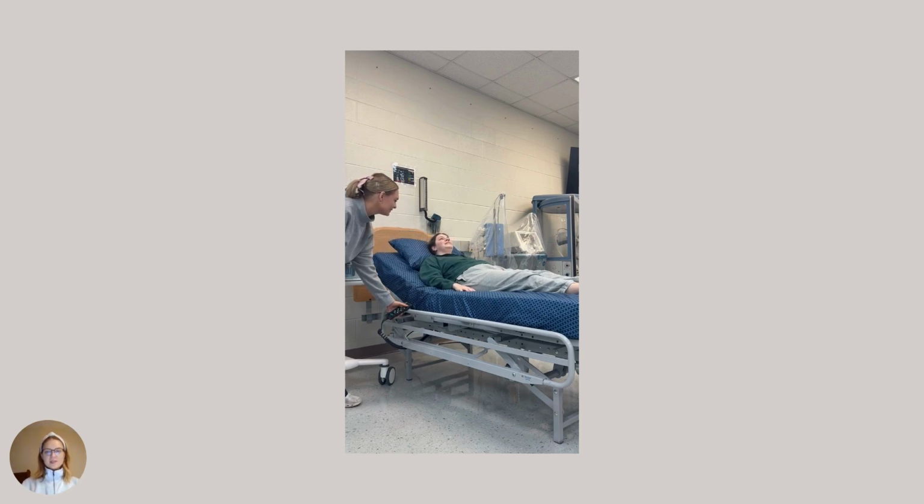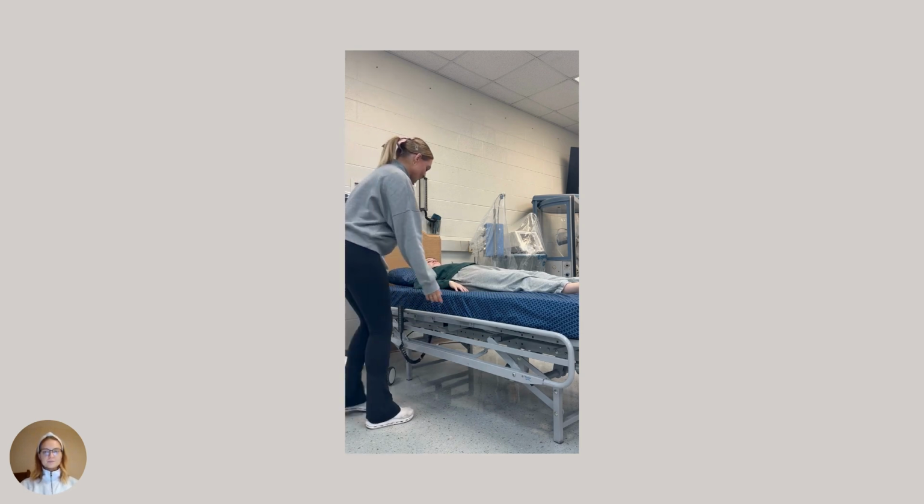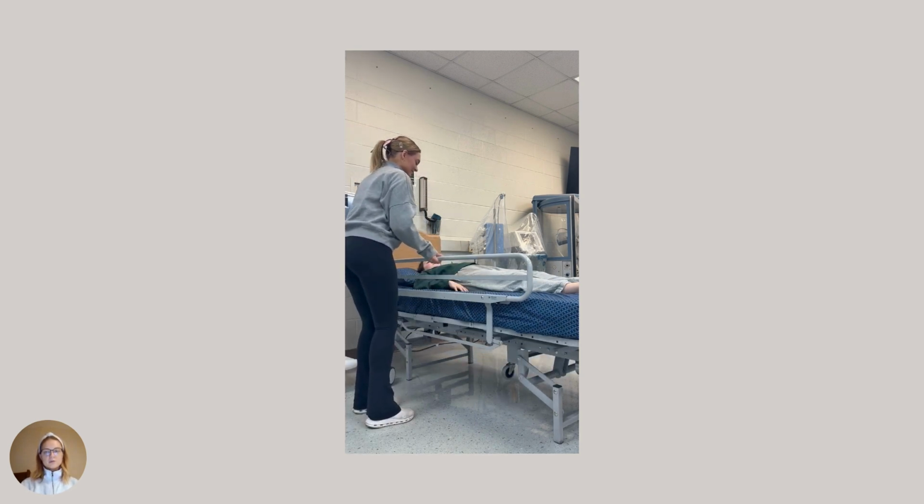Hi, my name is Autumn Sanderson, and this is the end of part 5 of my presentation on prone positioning and the ARDSnet protocol. As you can see here, I am demonstrating what it's like to have a patient on a ventilator who I need to prone.